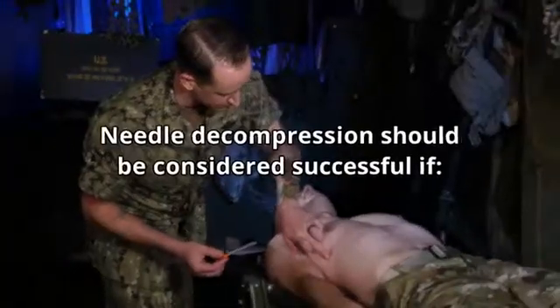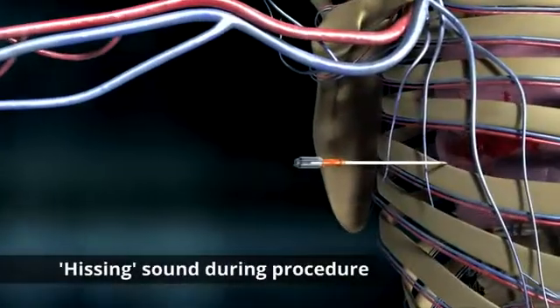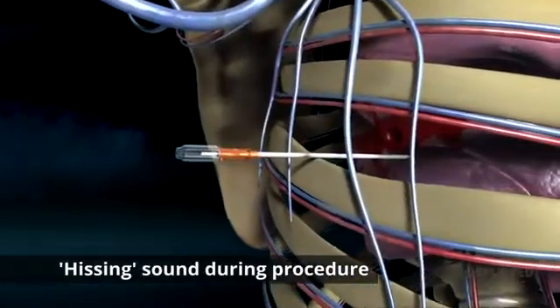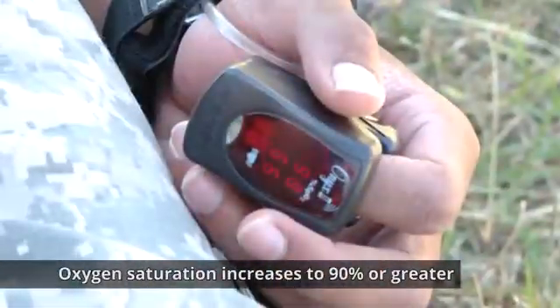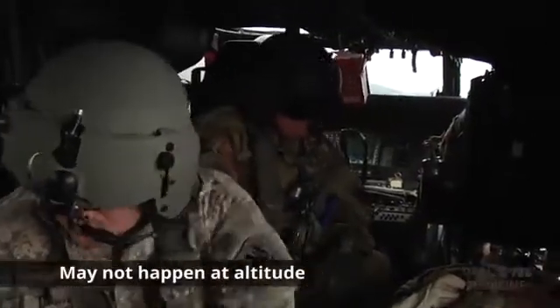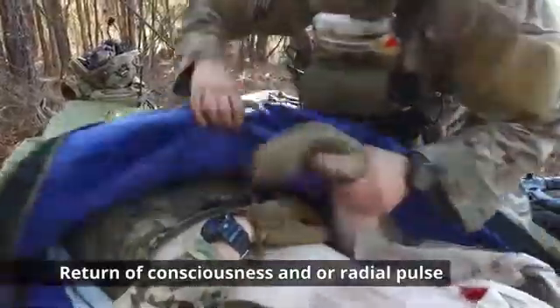The NDC should be considered successful if respiratory distress improves or there is an obvious hissing sound as air escapes from the chest when NDC is performed. This may be difficult to appreciate in high noise environments. Success is also indicated if hemoglobin oxygen saturation increases to 90% or greater. Note that this may take several minutes and may not happen at altitude. Another indicator is a casualty with no vital signs who has returned to consciousness and/or radial pulse.